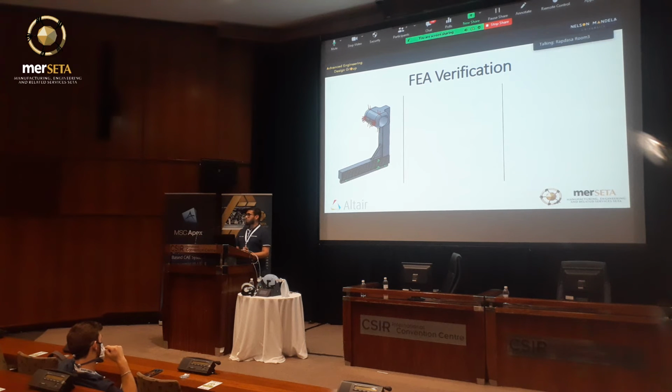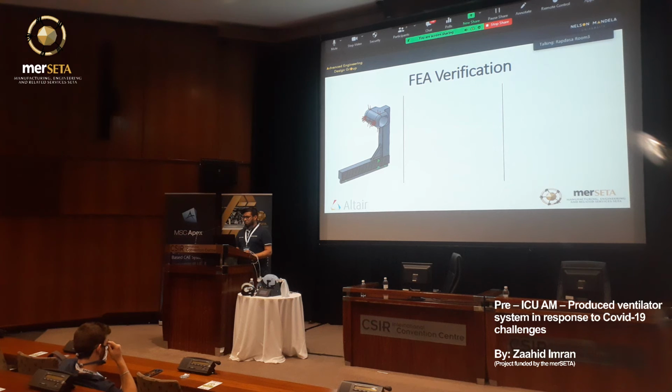The most important aspect of this ventilator system is the pusher arms, as this is the system that basically inflates and deflates the Ambu bag. So we therefore performed FEA verification tests to basically validate these parts. Linear static simulations were performed with the boundary conditions set at the worst case loading scenario, the worst case loading scenario that the pusher arm will ever experience.